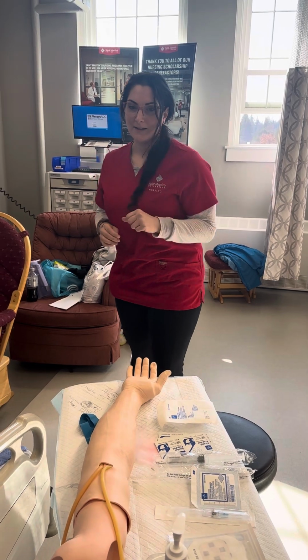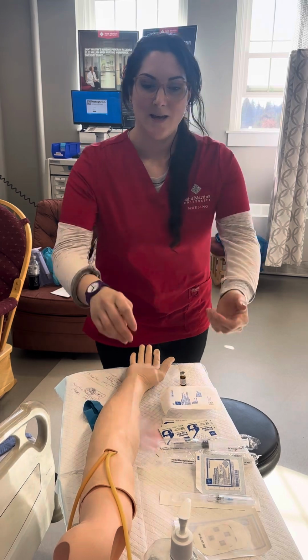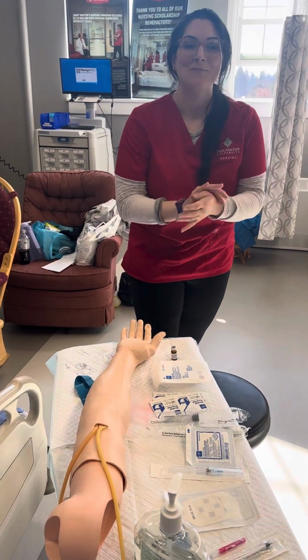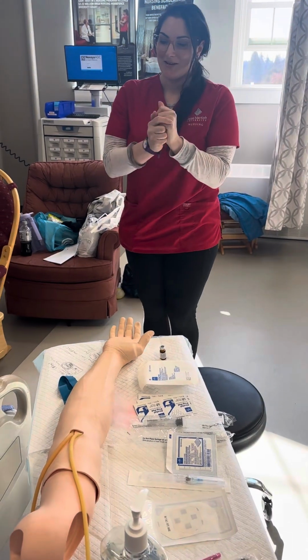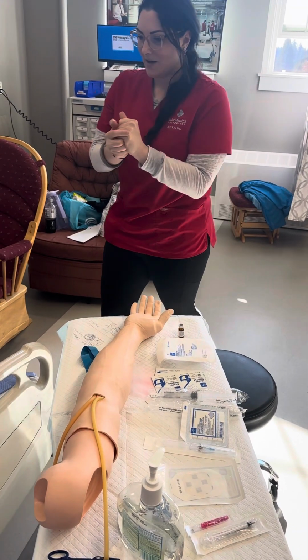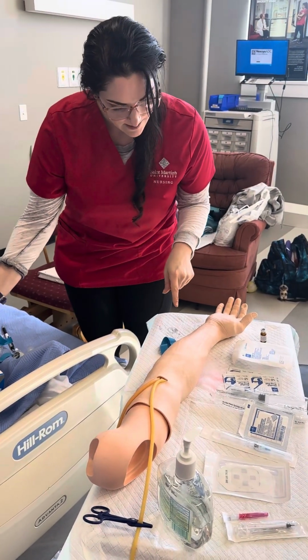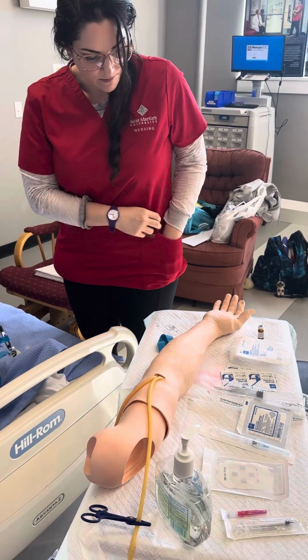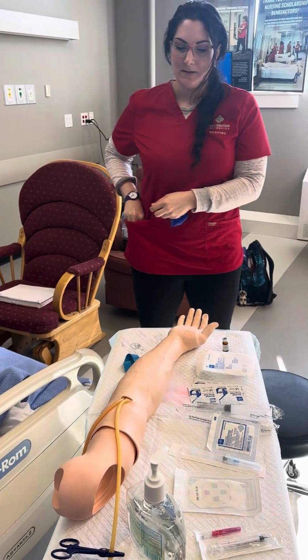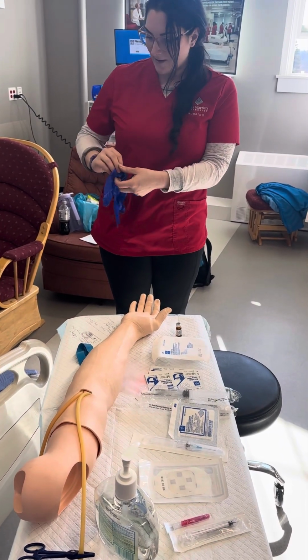All right, knock, knock. Hi, Scott. I'm Sarah. I'm your nurse today. Hand hygiene, privacy. I'm going to be doing your IV site and administering your pain meds today. I'm going to go ahead and check your badge, name and date of birth, please. Awesome, that's you. Any questions? Have you had an IV site put in before?